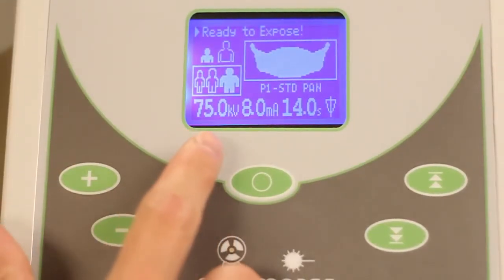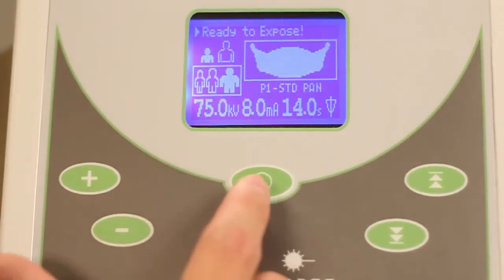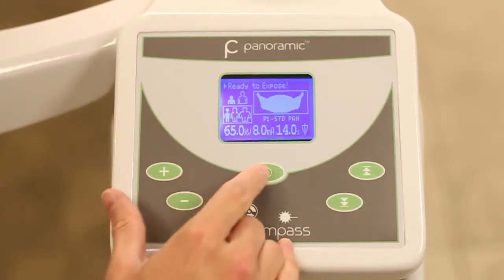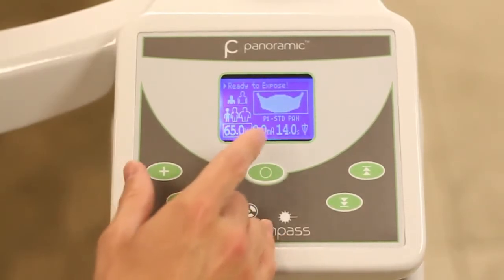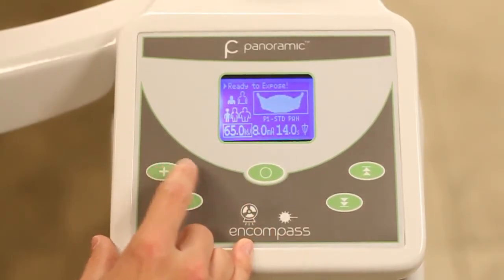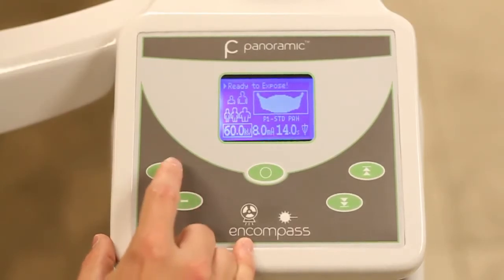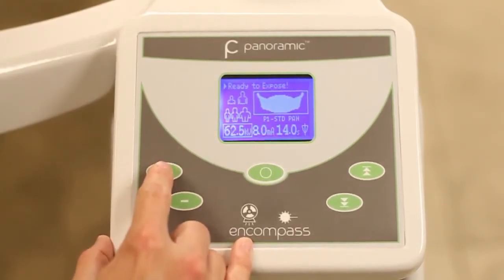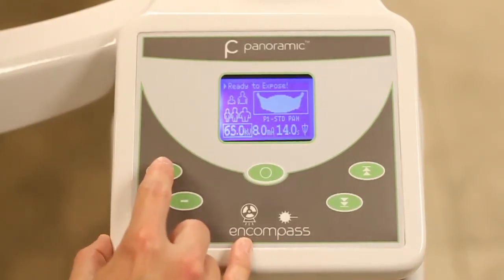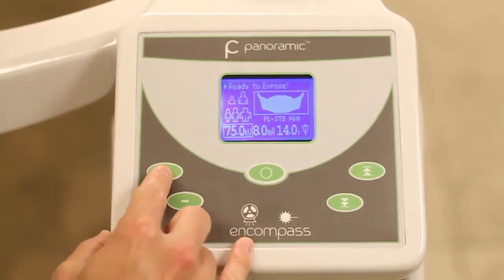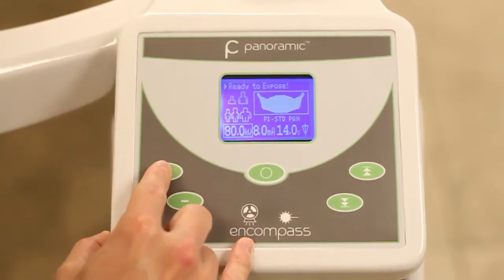Once these steps have been completed, the KVP will automatically be populated with factory settings based on the size and type of each patient. If it is determined that further adjustments should be made, the KVP can be increased or decreased in increments of 2.5 KVP. This is achieved by using the select button to highlight the KVP area, then making any adjustments using the plus or minus buttons.